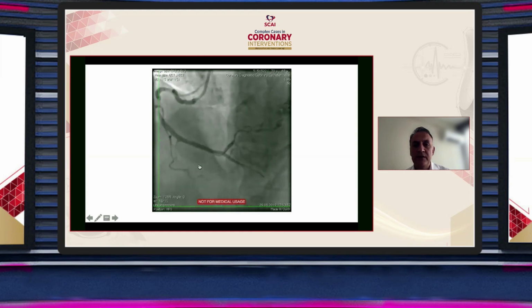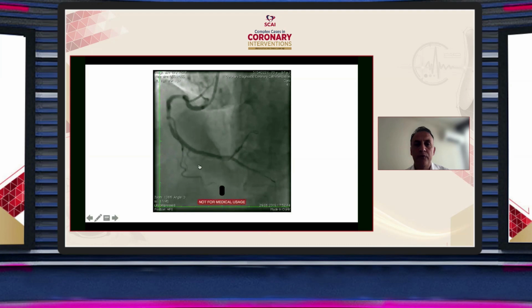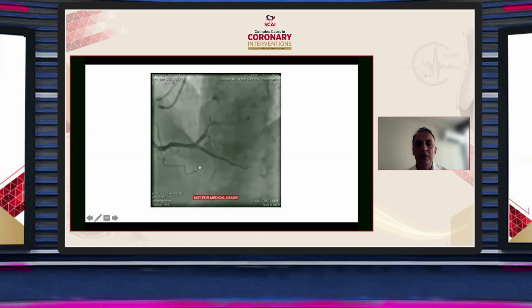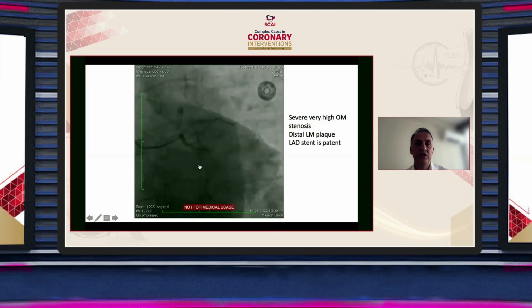So how can we treat this? Yes, we can coil this, and also before coiling or doing anything else we can try long balloon inflation, and sometimes it could work. In here, it did work. I'd like to show you this. After long balloon inflation, we don't have any more bleeding, and of course we have to very carefully watch this patient in the CCU.